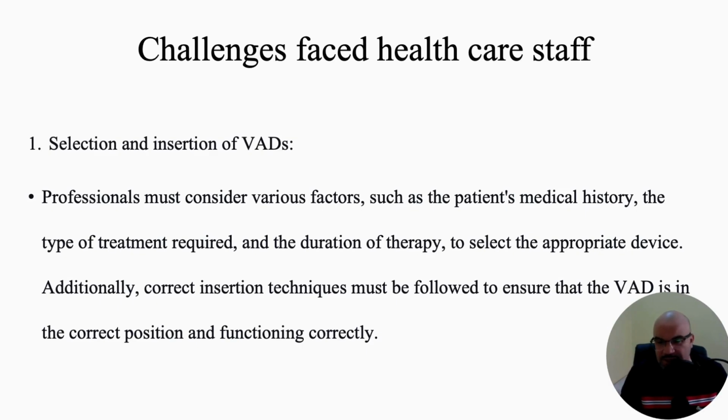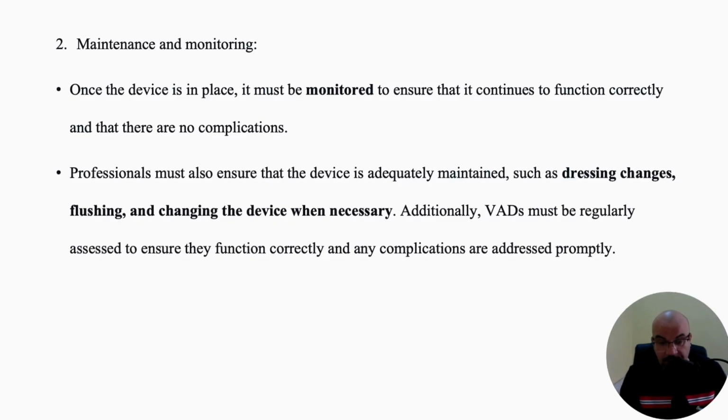So if the patient gets a chronic treatment, we will need to change the location of the cannula several times, which impacts the quality of life for the patient.